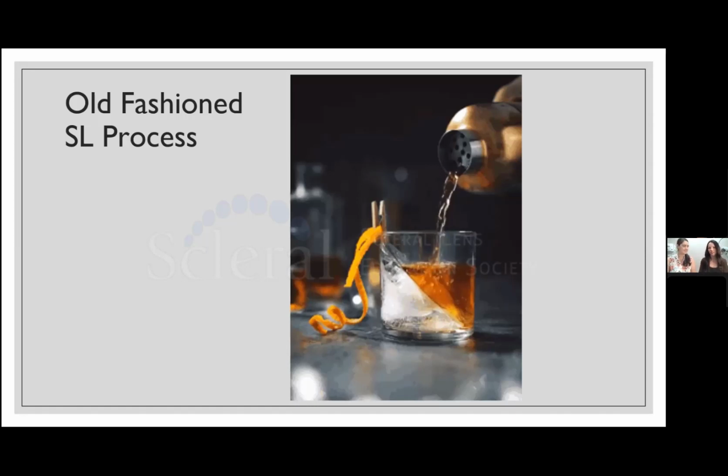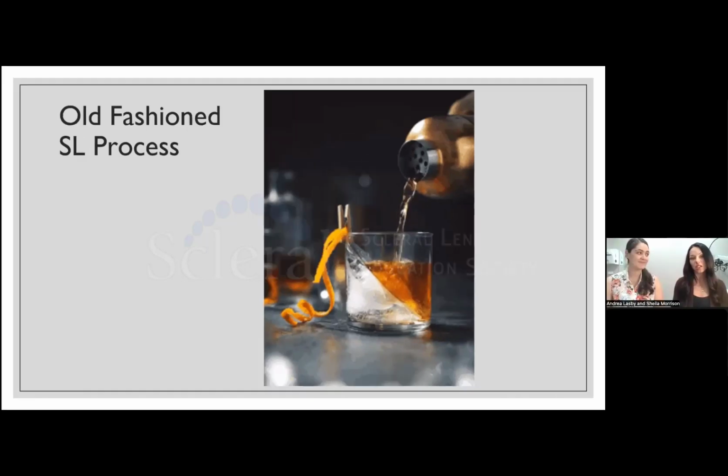On that note, our technicians are really our greatest secret weapon, because without them, and it takes training. It takes a long time of putting in the time with them ahead of time, that infrastructure, so that they can actually handle those diagnostic fitting sets to start your fits for you, putting lenses on an eye to figure out that refraction. Technicians are certainly super valuable, and our staff really are a frontline in so many ways. Putting time into them first, making sure they're totally competent and qualified to help do those basic steps that Andrea mentioned, getting a lens on the eye, looking at the sagittal height.